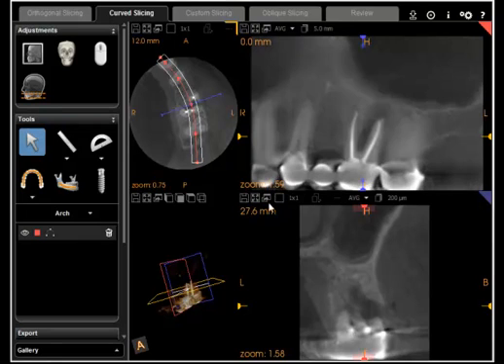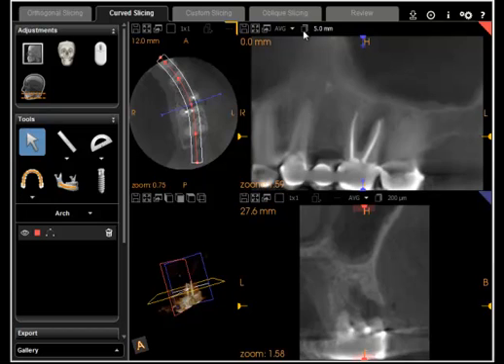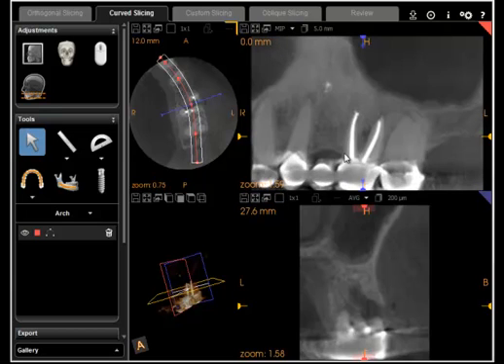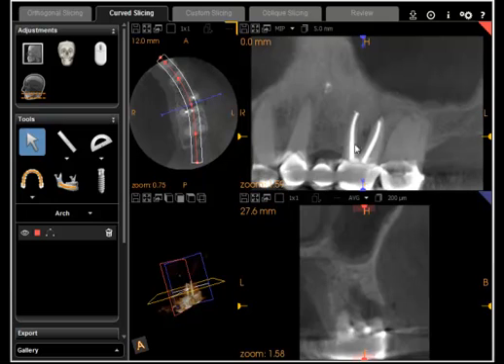On a larger volume scan this would be analogous to a panoramic view. Sometimes when you thicken the slice it becomes somewhat fuzzy. A second option is to click on the MIP button right up here, and that usually gives you a little more detail on a thicker slice.